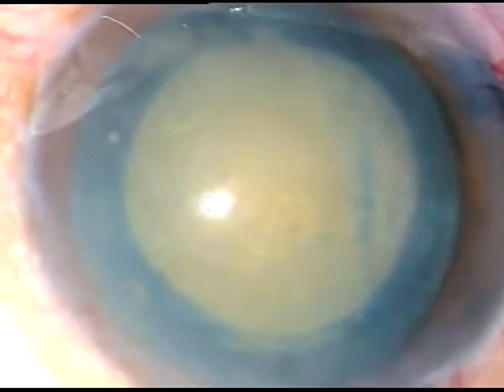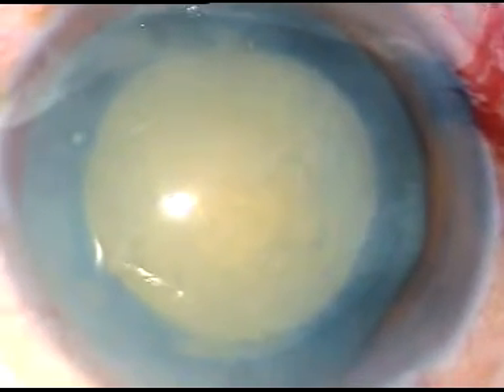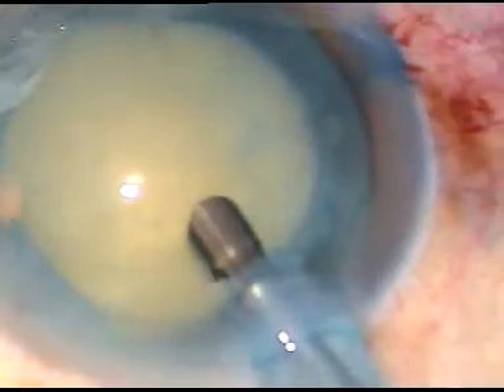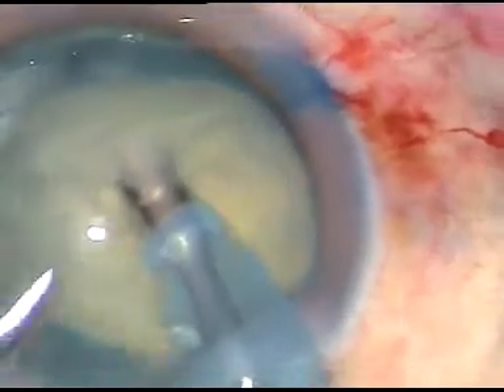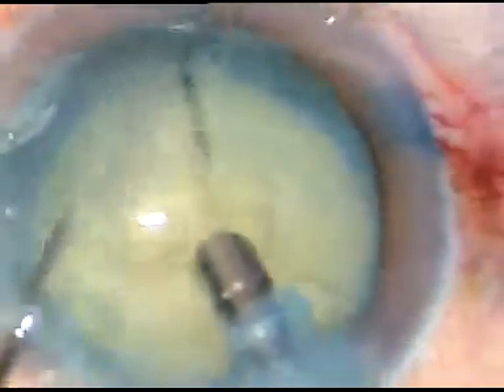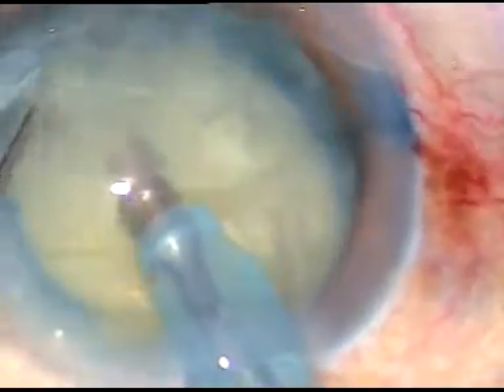The aim of this video is to show how to play with the PHACO tip. Turn the tip towards the lens matter for better followability. In this case, I am holding the nucleus in bevel down position and chopping it. You can see the endonucleus — holding it in bevel down position and chopping it. We can do it in bevel up position also; I just did this for a change.